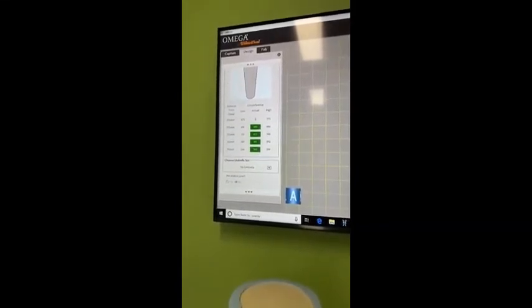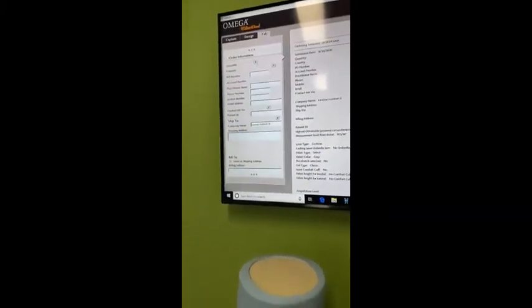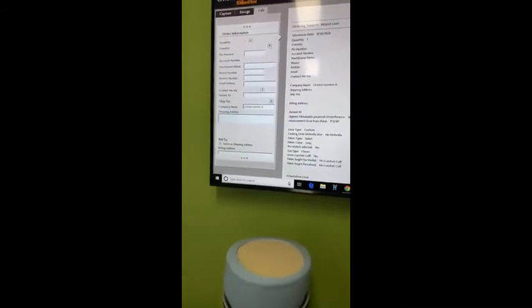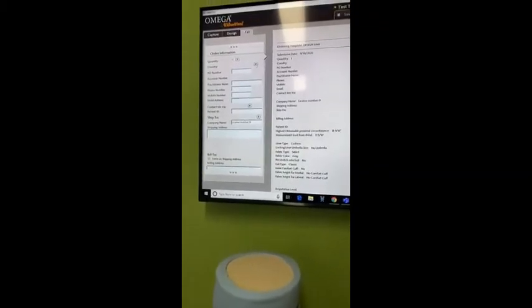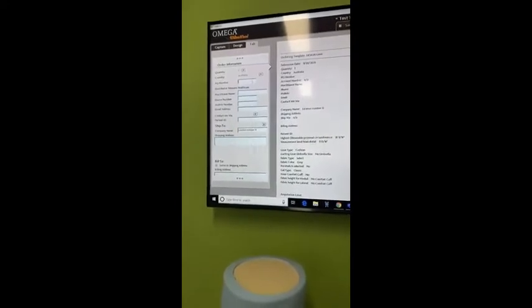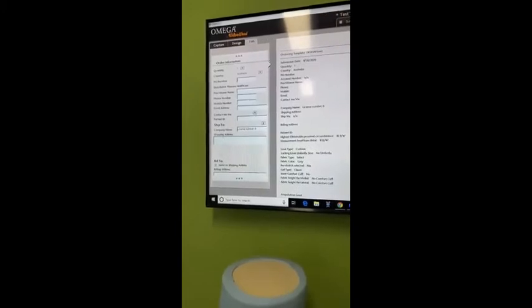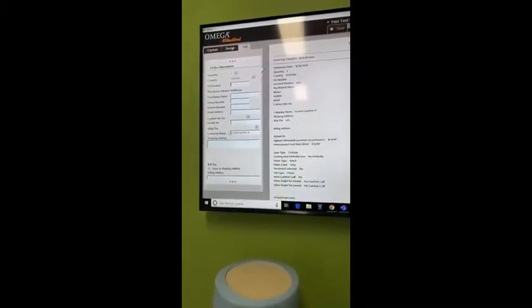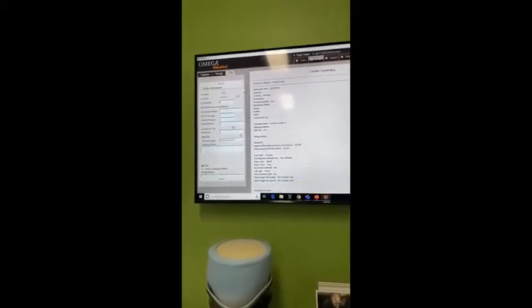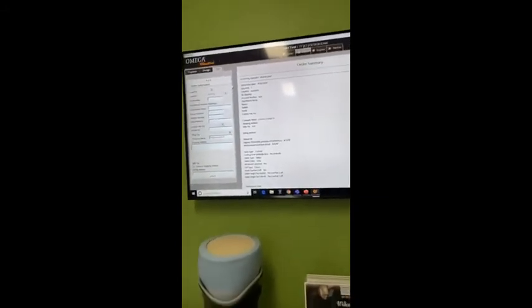And then, yeah, you would head to the fabrication stack. So this is where we would enter the quantity of liners, 1 or 2, depending if it's a duplicate, we can order duplicate liners. We choose Australia. Basically put in all the fields here, and then once it's all filled in and everyone's happy with it, we send that off to WillowWood to start fabricating. So I'll move out of this and we'll go to a BK.